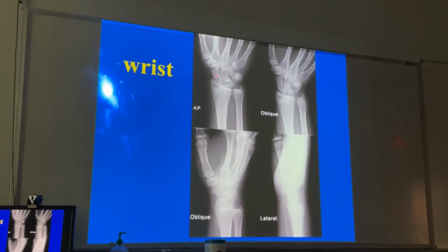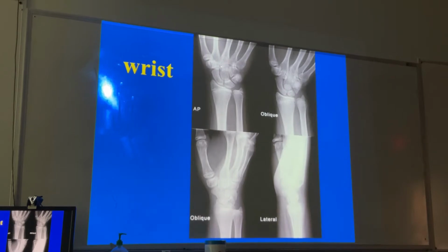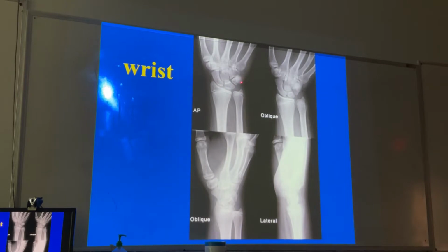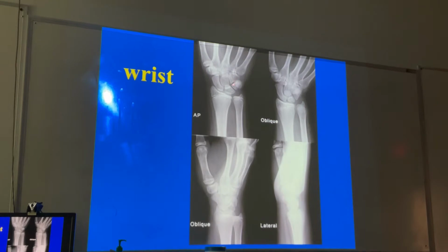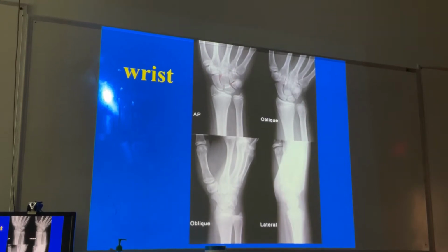What's this? Scaphoid, okay? And notice there's radiolucencies between the joints, so the intercarpal joints are symmetric. You get one concentric line when you do this. The proximal should be a nice smooth uninterrupted line. The distal portion of that joint space should be concentric. And the joint space anterior to that will give you 3 concentric arcs. That's when you know there's normal alignment.